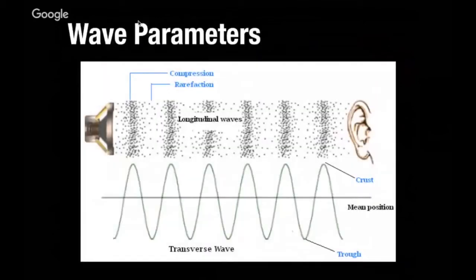The bottom picture is how a lot of us have been conditioned to think about waves from physics books. And I always thought that meant that when a wave was propagating through air or tissue, there were things going up and down like this. And there are, when there's some kinds of materials, this is the way that a wave in the surface of water looks. So we can conceptualize some waves that way. It's not a great way to conceptualize what molecules are doing when you apply pressure to them with ultrasound.